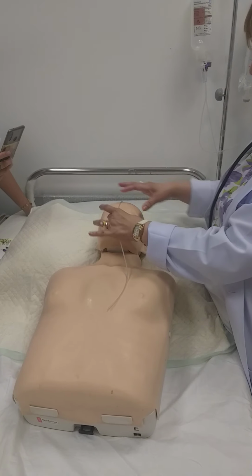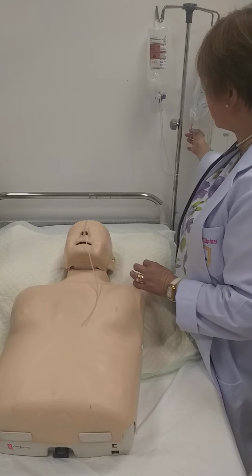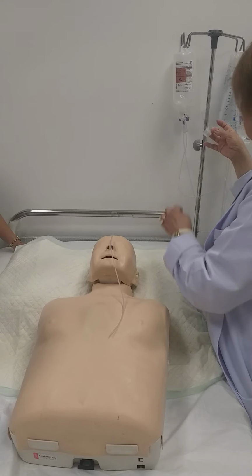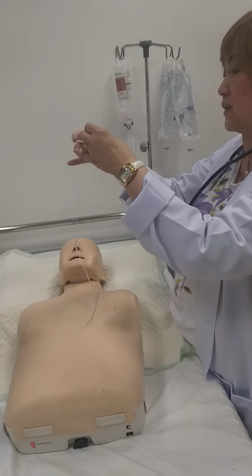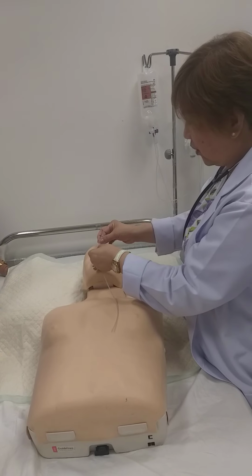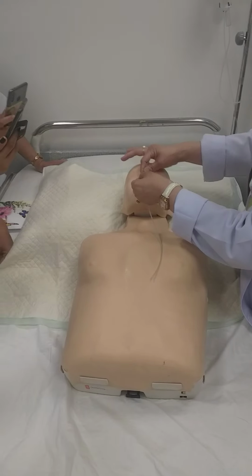Okay? So it is there. Second, you take the one that you made half. This is the second with the half. Okay, so this is the second, the one we cut. So place that upper part on the nasal bridge.